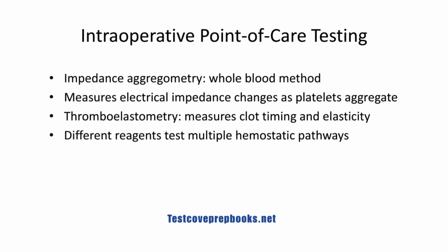Intraoperative point-of-care tests are used to support highly invasive and high-risk surgeries. Impedance aggregometry. This is a whole blood method of platelet aggregation. It measures electrical impedance changes as platelets stick to electrodes. Thromboelastometry. This test measures the timing and elastic properties of clot formation throughout the entire clotting process.